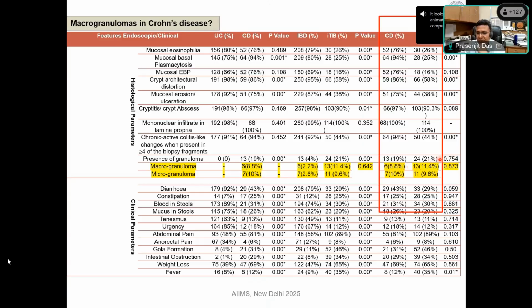So what did you learn? Macrogranulomas and deeper granulomas are very classical, or more classical, of intestinal tuberculosis, but rarely can be seen in Crohn's disease. However, initially we cannot favor Crohn's disease. So only after a treatment trial, on repeated biopsies, can we assess and discuss them. That is how we analyze these cases.